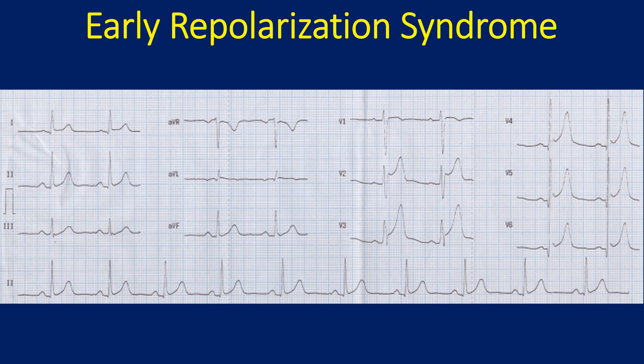Another ECG showing early repolarization syndrome, evidenced by the concave upwards ST segment elevation in leads V2 to V6. A closely similar pattern can occur in the hyperacute phase of myocardial infarction. Moreover, persons with ERP syndrome can also develop myocardial infarction. So, if the clinical history is suggestive of ischemic cardiac pain, it is better to have follow-up with serial ECGs and troponin estimations.